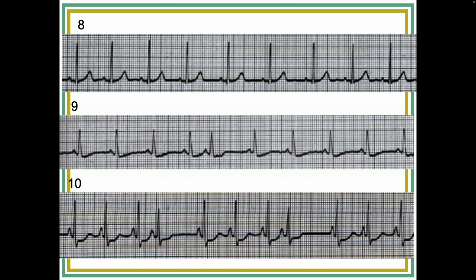What was the difference in R to R's? Three small boxes. Okay. So in that particular case, first of all, am I sure that's not a sinus arrhythmia? No, I'm not. It could be, in fact, because I see how there's several that are longer and several that are shorter. I think you picked that up last week as well, so that was good.